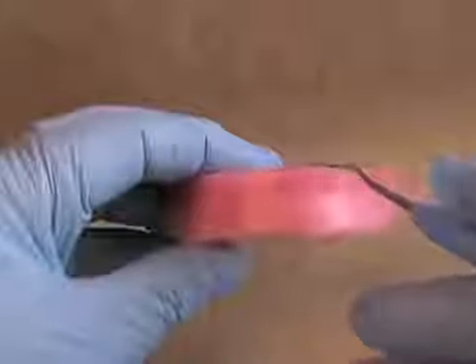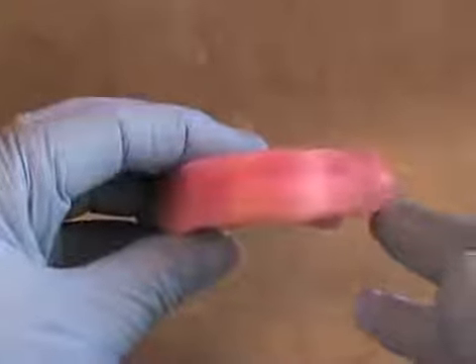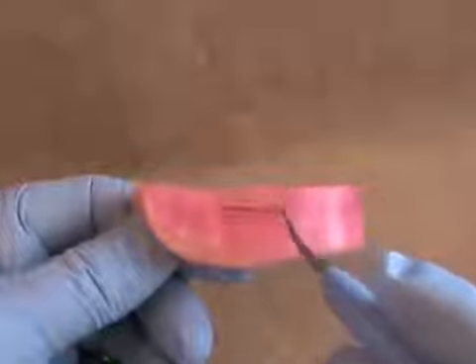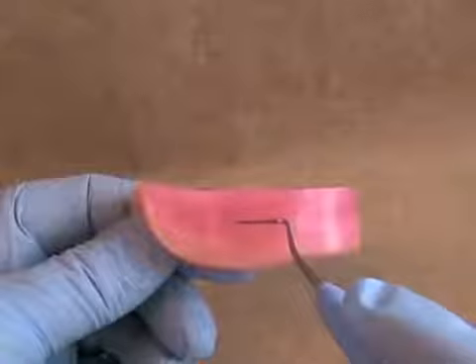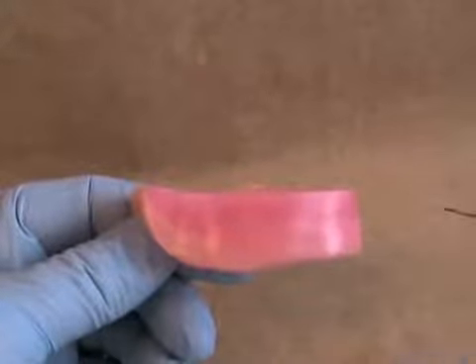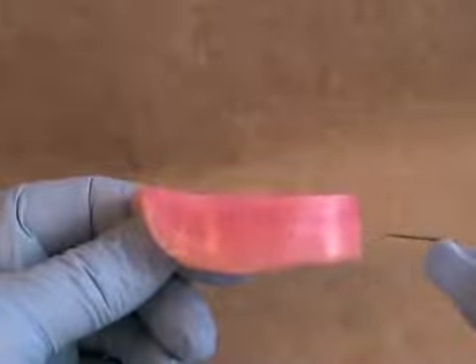At rest, the occlusal plane of the mandibular rim should be at the level of the corners of the patient's mouth. Posteriorly, the edge of the occlusal plane should intersect somewhere around halfway up the retromolar pad. If this occlusal plane is too low, the patient's tongue will lap over the top and the patient will accidentally chew their tongue. If the occlusal plane is placed too high, then the patient will struggle as their tongue has to move up higher to replace the bolus of food on top of the occlusal table during chewing. The patient will fatigue and will report a sore tongue.